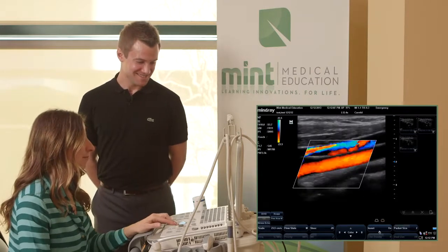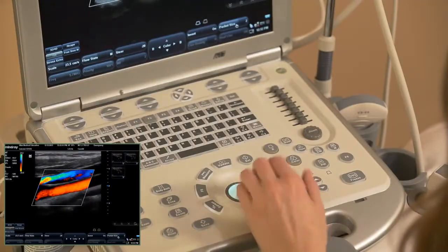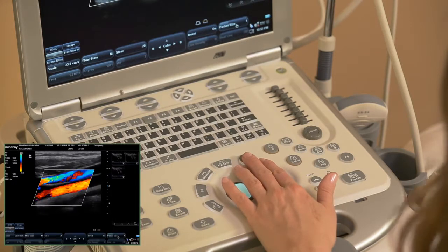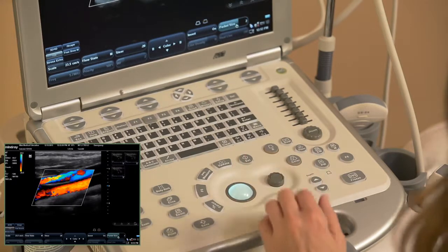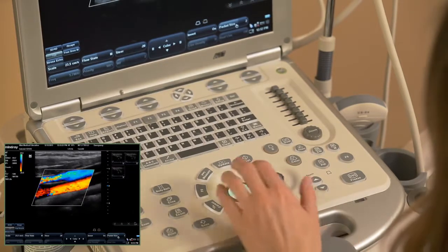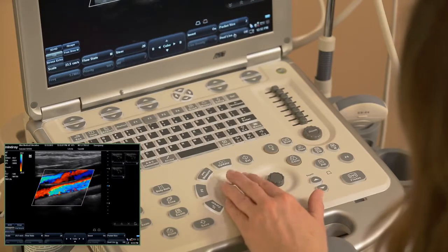Yeah. Okay, so packet size. Do we need to? Let's see. What does this do? And you can always try it. Yeah. Typically, that isn't something that most users will use. Okay. Maybe a little bit more of an advanced user may find that they'll mess with that a little bit. But we won't use that before your clinical application person gets there.